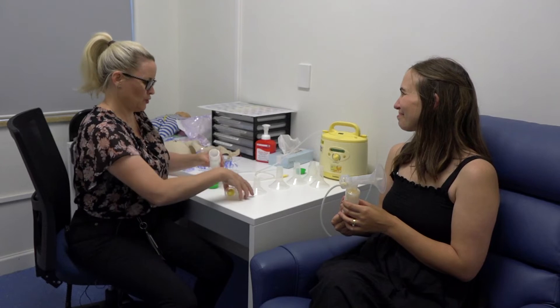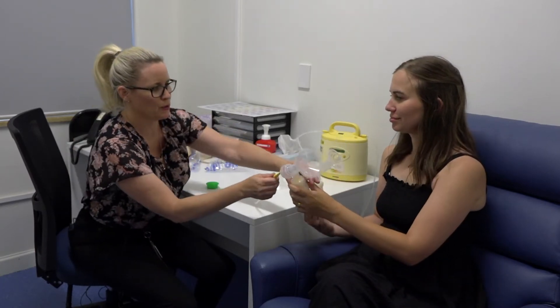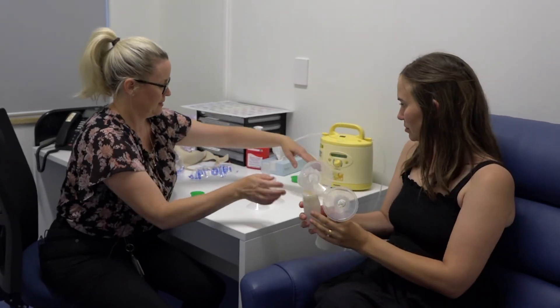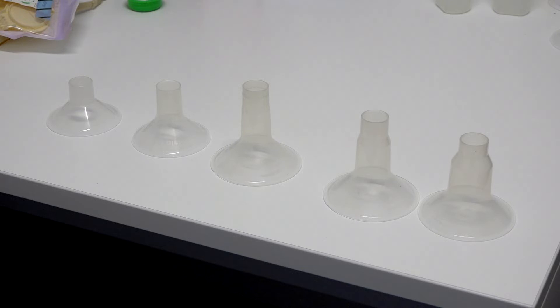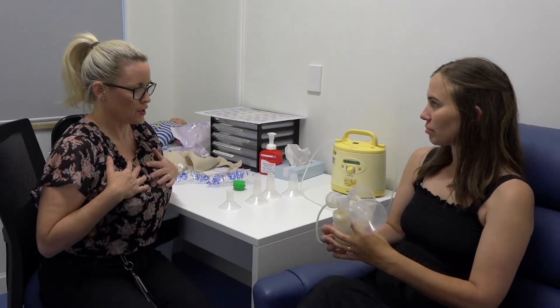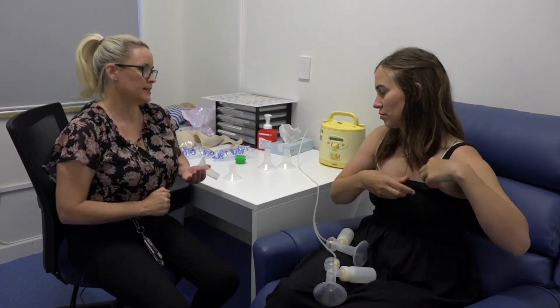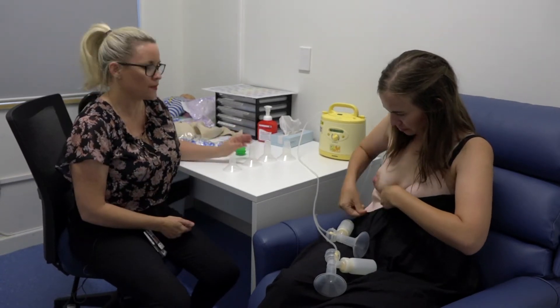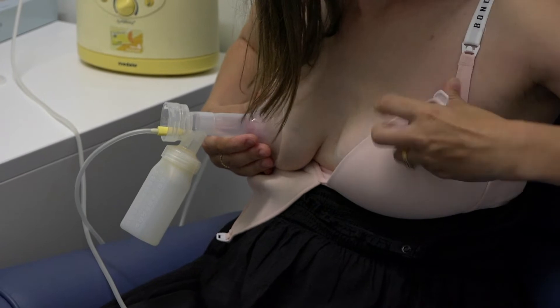If we're pumping both breasts we would need to set up the other side too. You might notice for our demonstration purposes that I have different sized shields — in ascending size: 21, 24, 27, 30, 36. The right size is the one that comfortably fits you without any rubbing or chafing and where milk flows freely. We've worked out for you that a 27 is your size. Place the shields over your breasts, making sure you centre the shield so the nipple is sitting centrally in that little tunnel, because we want even suction pressure over your breasts.